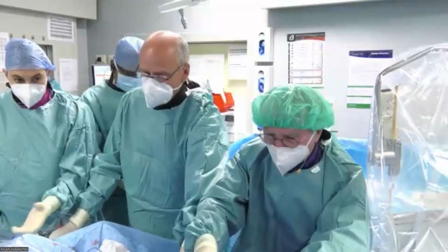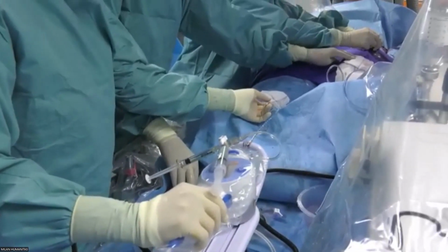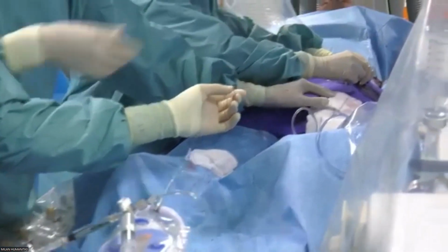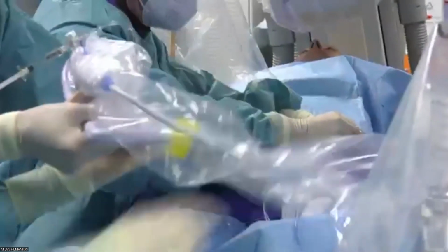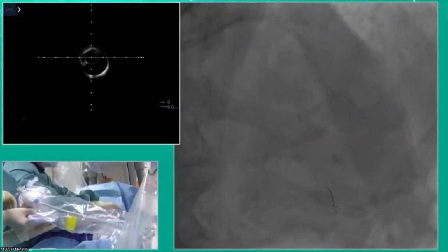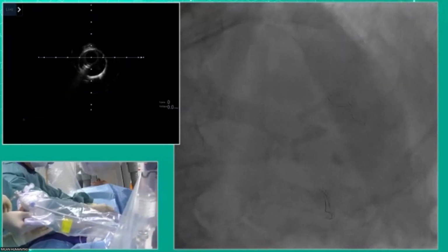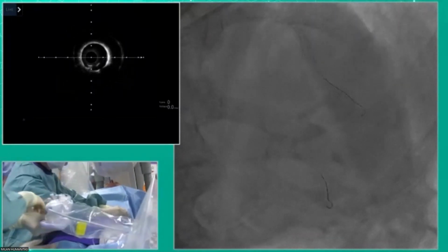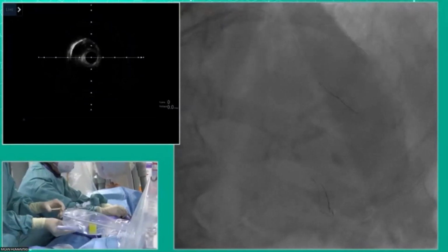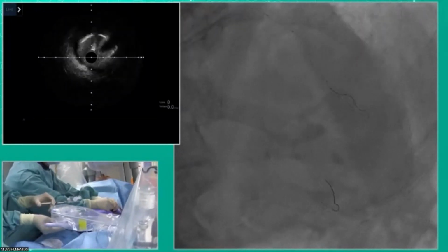So Dr. Colombo, Ajay Kirtane just came straight off the plane and I think he'll be very happy with your decision to IVUS here. So yeah, Ajay, you might not know this case, but 83-year-old asymptomatic, got PCI to the RCA and CERC. And then heavily calcified LAD, rotablated with a 1.5, balloon with a 2.5 distally, and in the mid LAD. Yeah, the reason why I may be a little bit reluctant to do IVUS, that I don't want that the IVUS force me to place a stent distal.